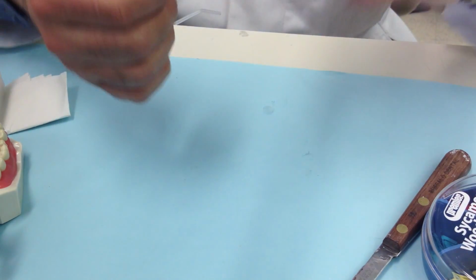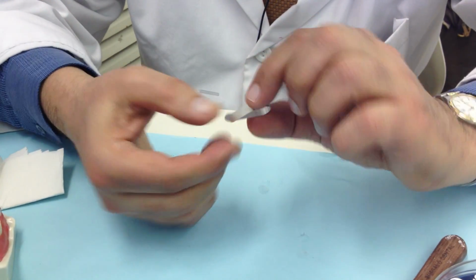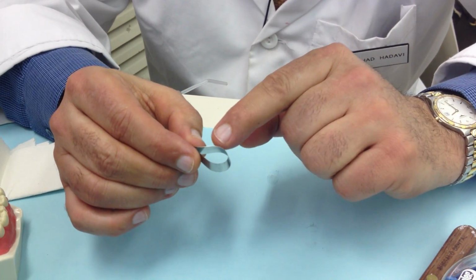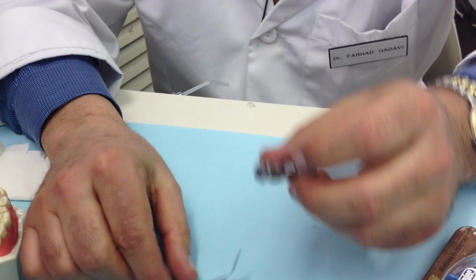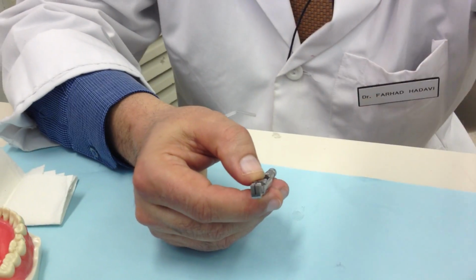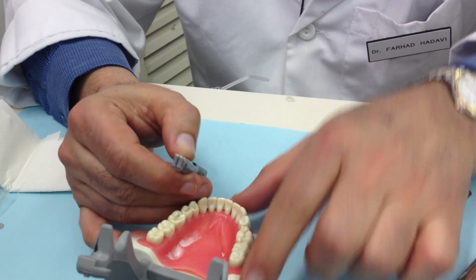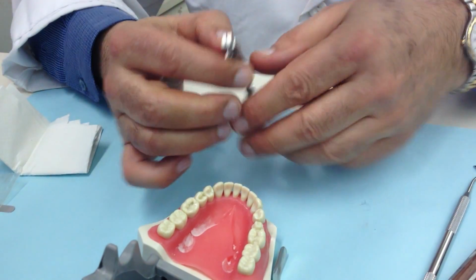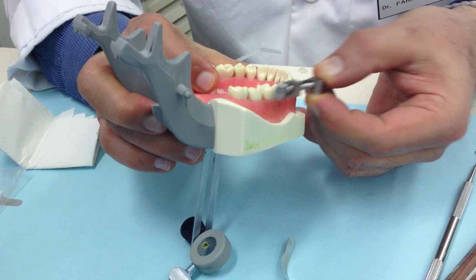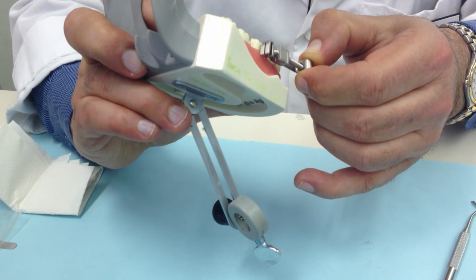Now, if I fold this one, you can see this is a small circumference, and the other side is a large circumference. I know that a small circumference should be toward the gum. Am I right? And also, I know that this open end should be toward the gum. And also, I know on the lower right side of the tooth, the flat surface should be toward the buccal surface. You can see when the flat surface is toward the buccal surface, the open end is toward the gum. Am I right? That makes sense to you?